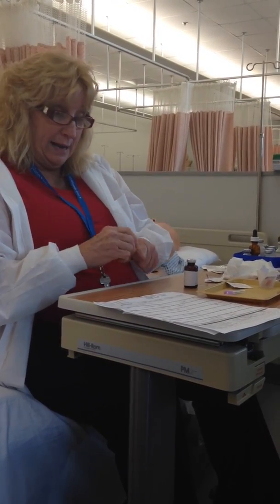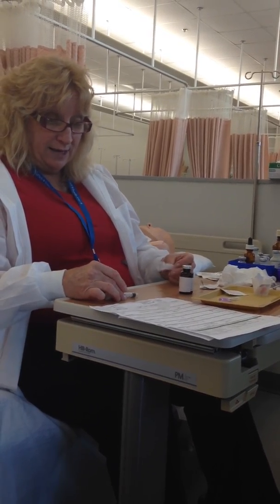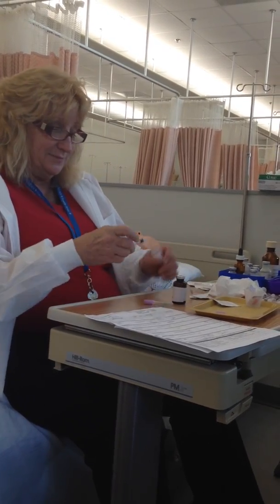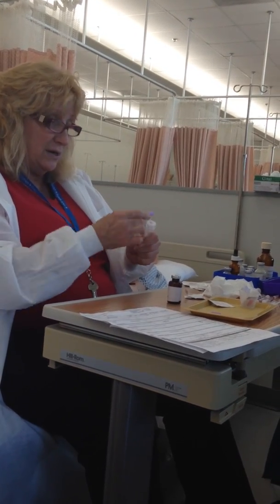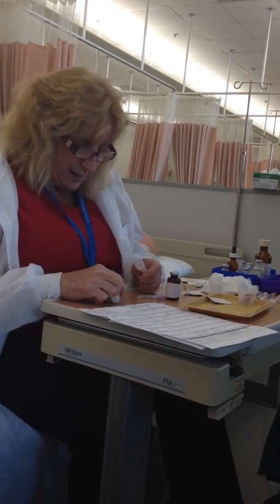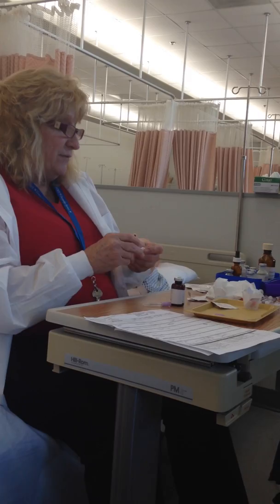It'll be open lab. So you take this out, and if you place it down like that, that's a fail. So you have to hold on to this. When you take these things out of the containers, you have to always hold them once you get the sterile caps off. And if you slide it, that's a fail. If you do something like that, you have to go get more.